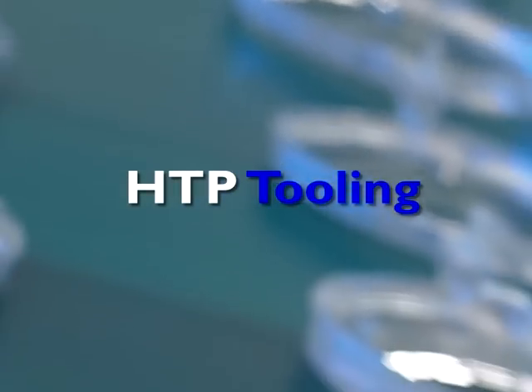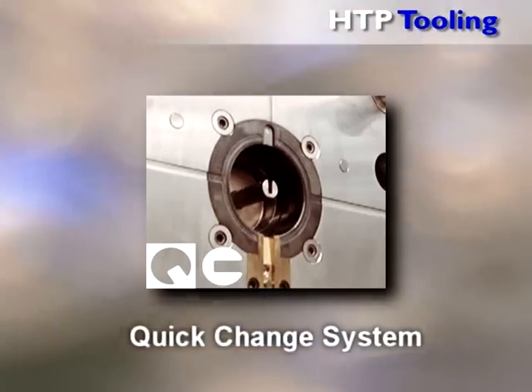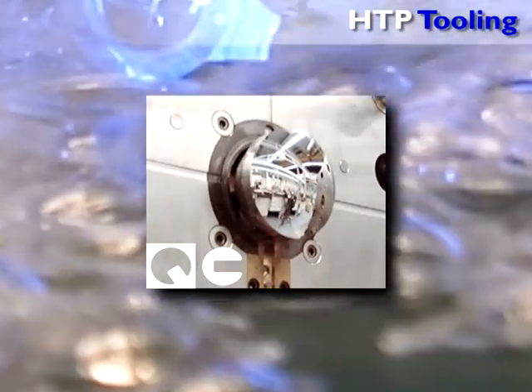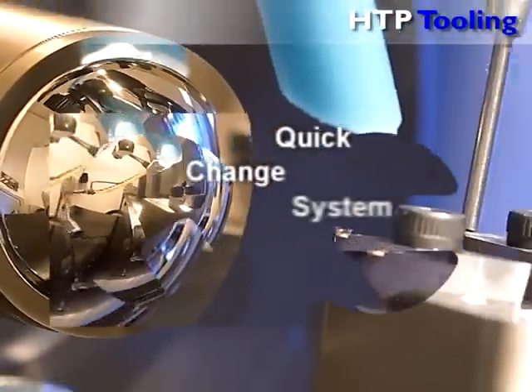Would you like to boost the productivity of your manufacturing operations by more than 20%? HTP Tooling's quick change system enables you to do just that. Years of experience in development and manufacturing of ophthalmic molding technology have enabled us to bring you the latest in spectacle lens manufacturing: our patented quick change system.